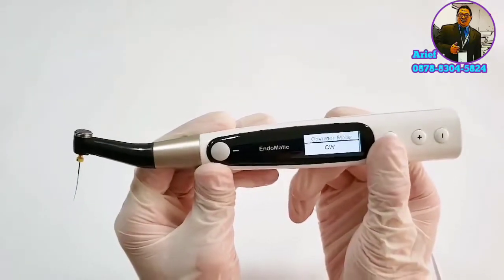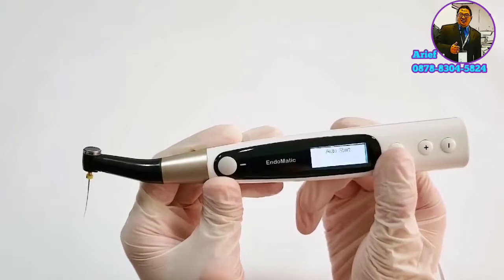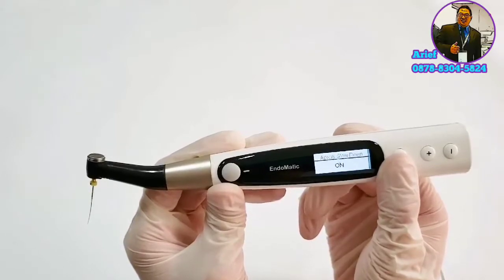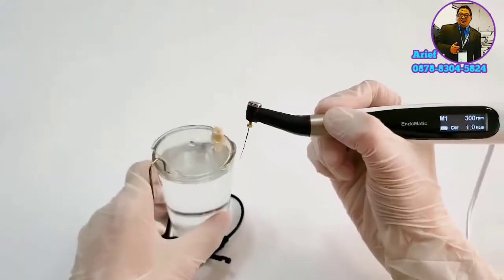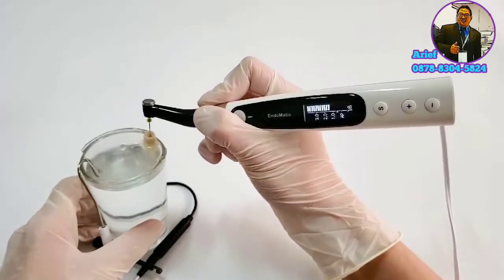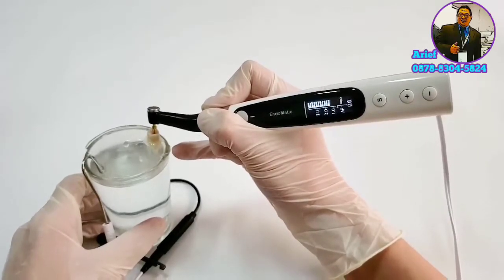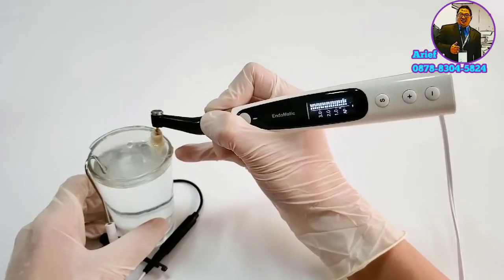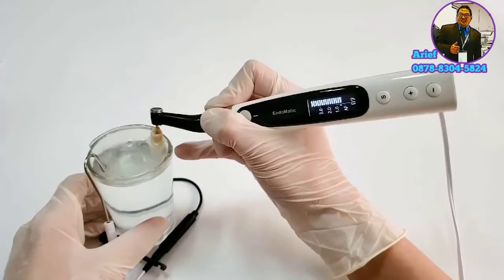Now let's select some modes for a demo: apical action set to reverse, auto start switched on, flash bar position set to physiological apical foramen, and slowdown switched on. Here is the simulator — you can see when the file is placed in the root canal, it works automatically. When the file approaches the apical foramen, the speed reduces, and when it reaches the apical foramen, it reverses automatically.